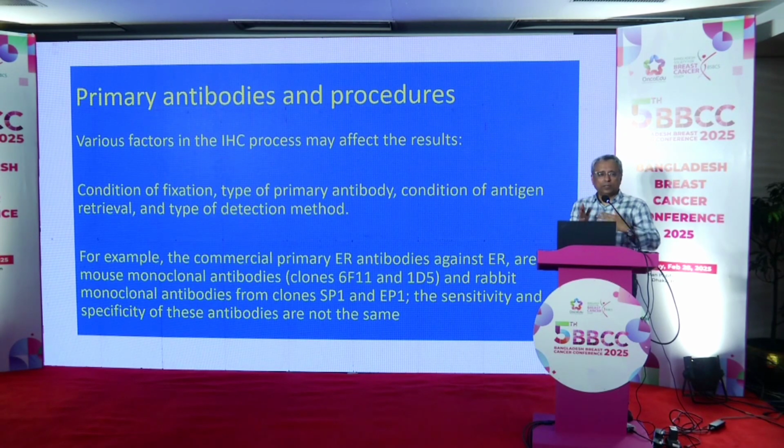Ideally, you should go with the clones that are recommended by CAP or the other regulatory bodies, so that it becomes standardized. But if 4 different labs are using 4 different antibodies and the protocol is not standardized, then if you do ER in one lab and you get a result, it will be very different from another lab using a different clone and different protocol.